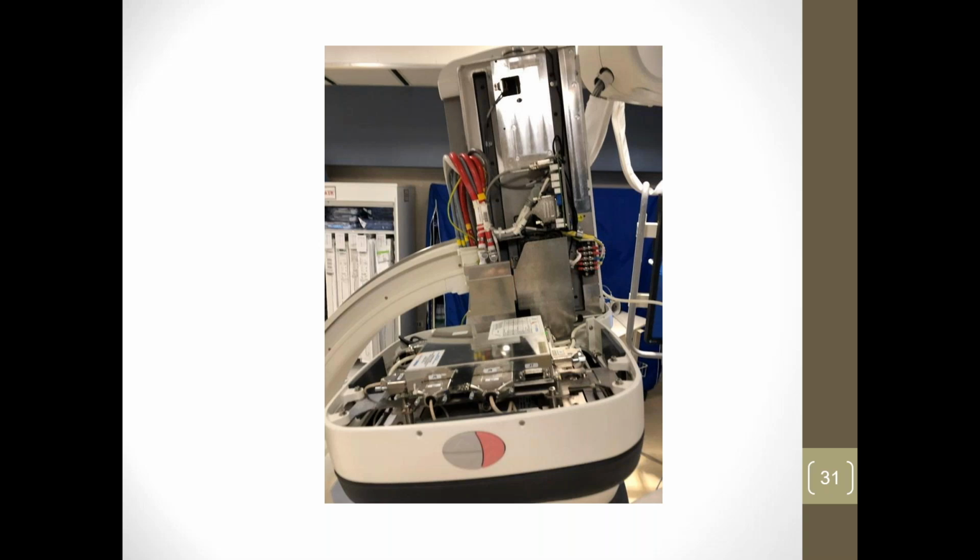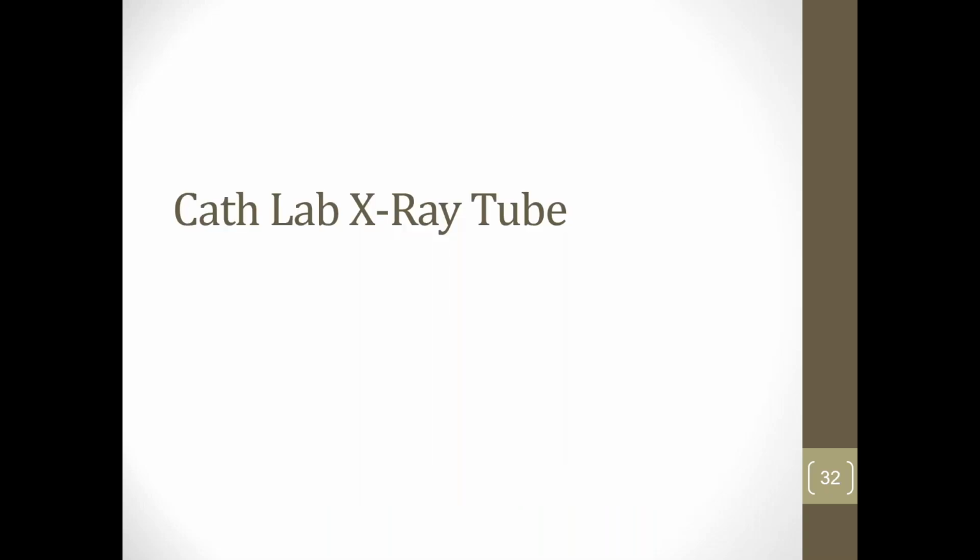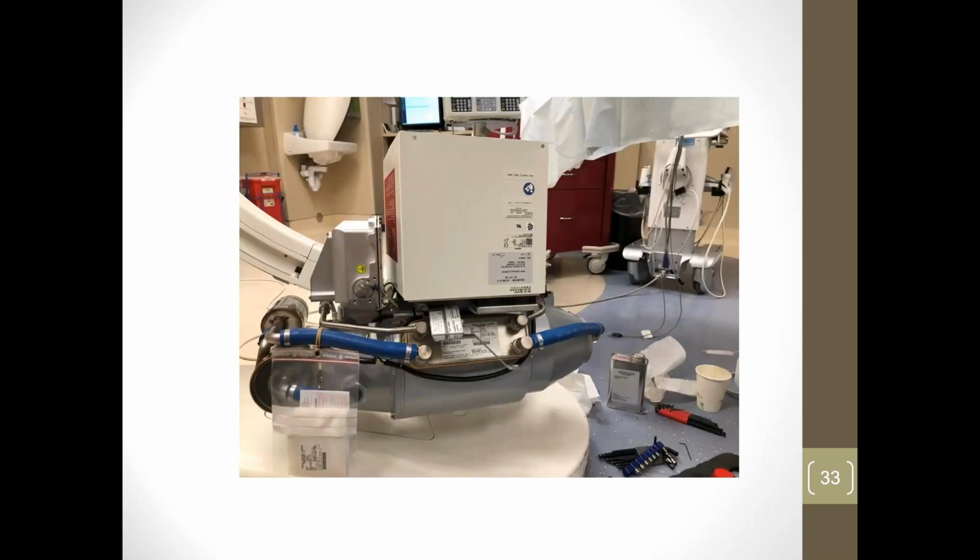The 30 centimeter is kind of like the minivan of the bunch. It's good at doing the vascular, bigger scans. So it's kind of the middle of the road for companies or hospitals to purchase. Okay, so now we'll cover an X-ray tube.